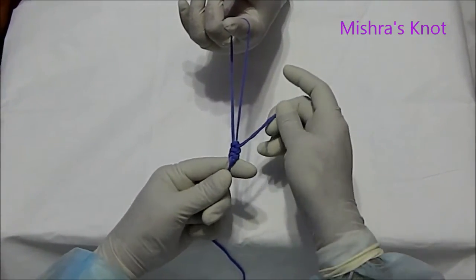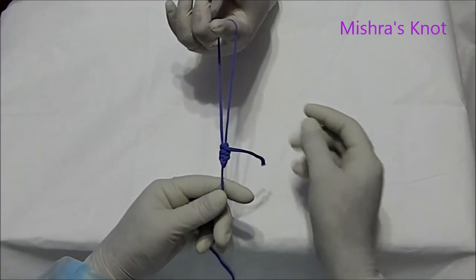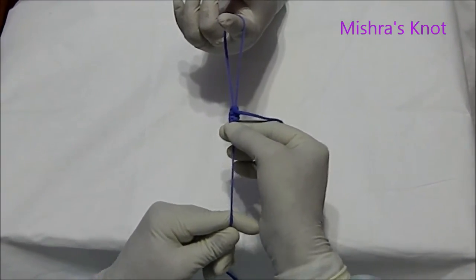And the knot is ready. With the help of the knot pusher, you have to slide it.